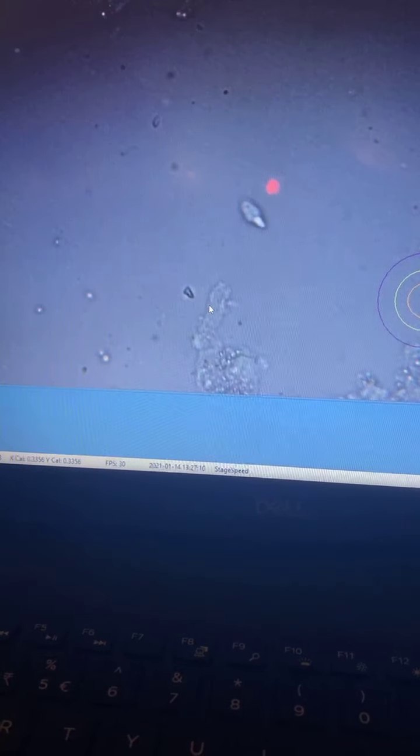Keep the sample in the incubator. The testicular sample which we have mashed up is now going to go inside the incubator. It is going to be cultured for the next two hours or so, and then I'm going to be doing ICSI.